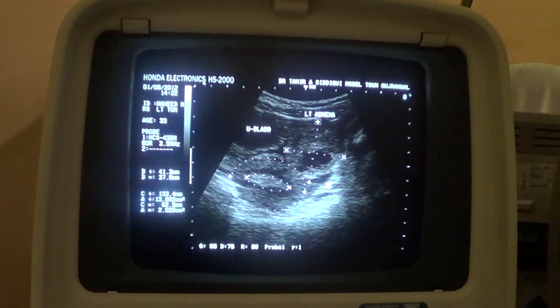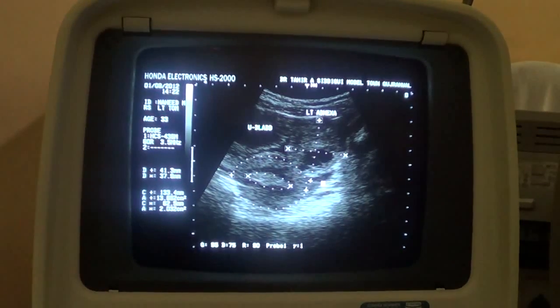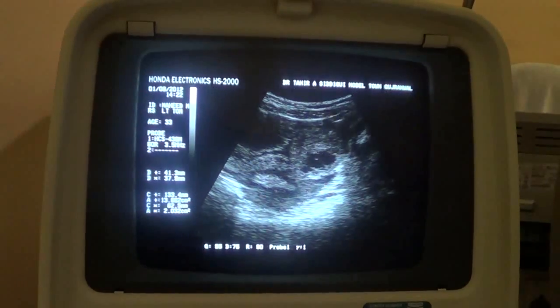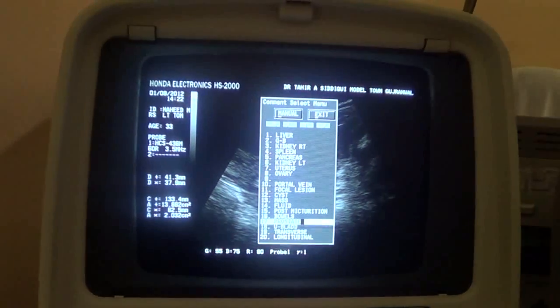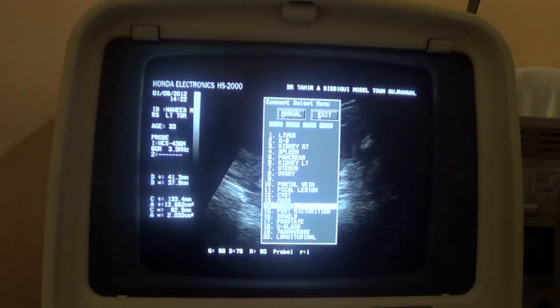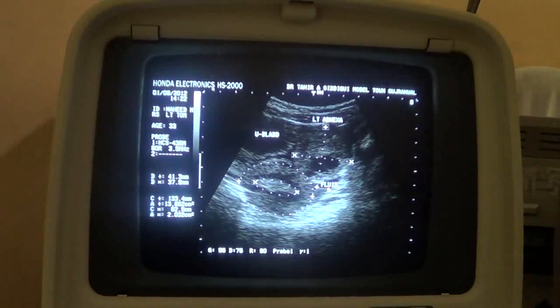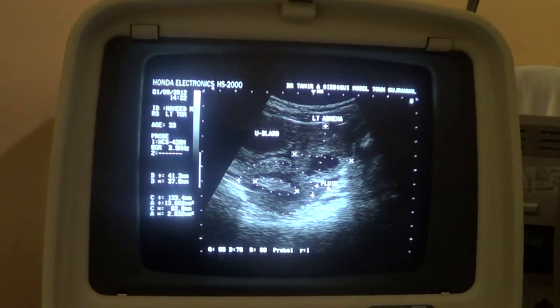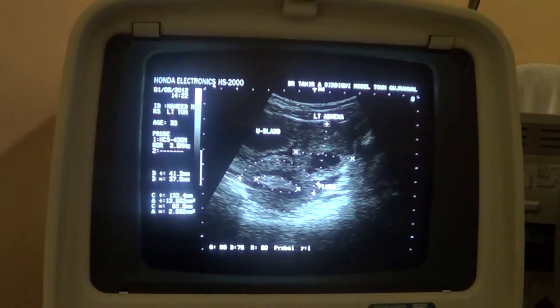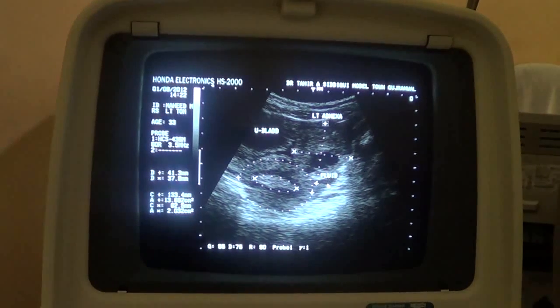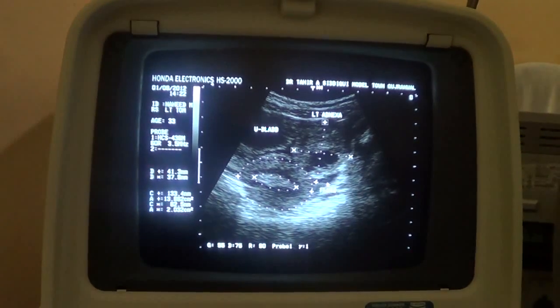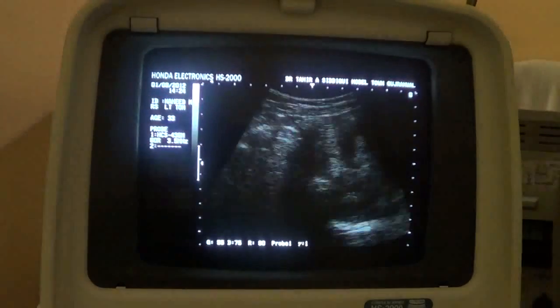This fluid is suggestive of this mass being infective in nature. This is the fluid — it is posterior to this mass, in the region of the left adnexa.